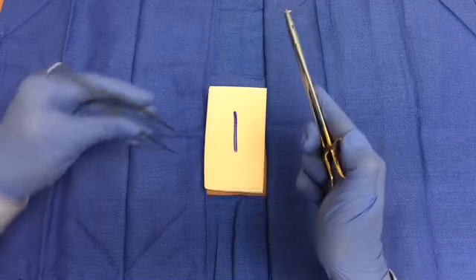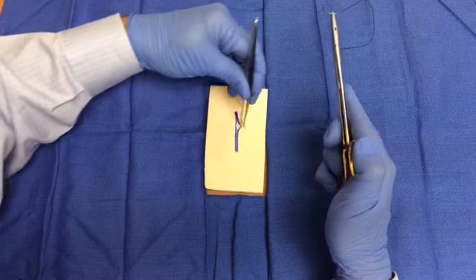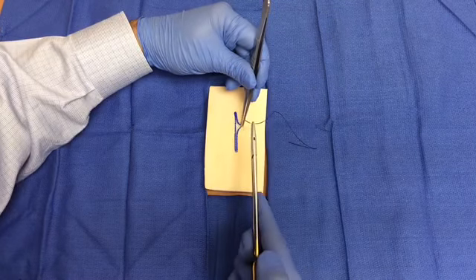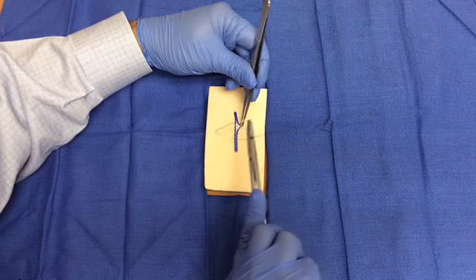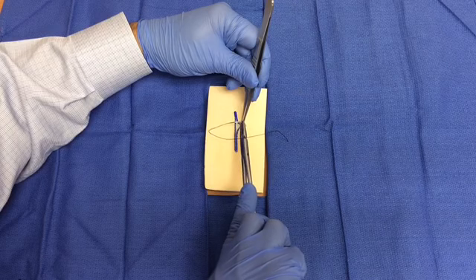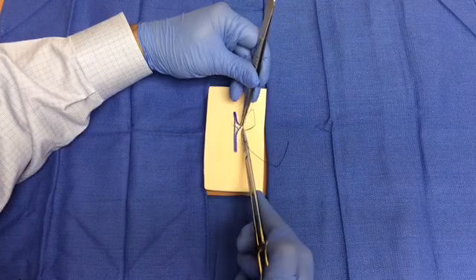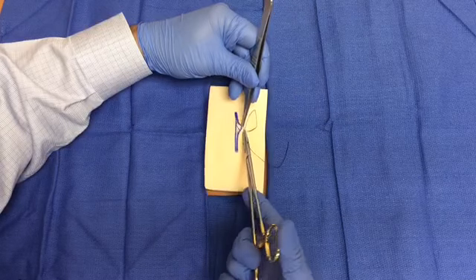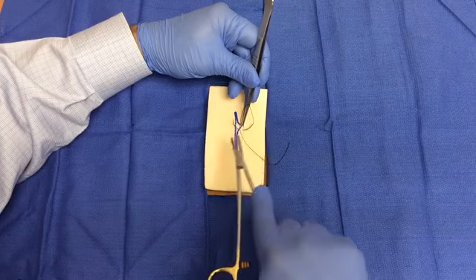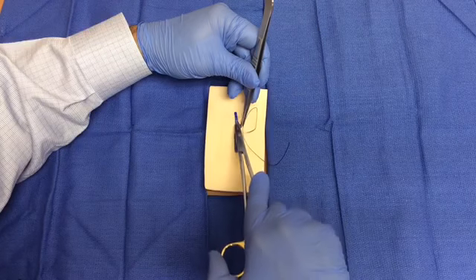To begin the instrument tie, grasp the left wound edge with the skin forceps and evert the edge. With the needle driver held in the prone position, hold the needle so its tip is perpendicular to the skin. Starting with your wrist prone, enter the skin and supinate following the curvature of the needle to feed it through the tissue. Release the needle driver then pronate to pick up the needle from the middle of the wound. Make sure to supinate as you bring the rest of the needle through the tissue to avoid any undue trauma.